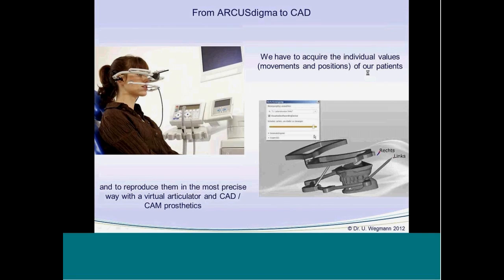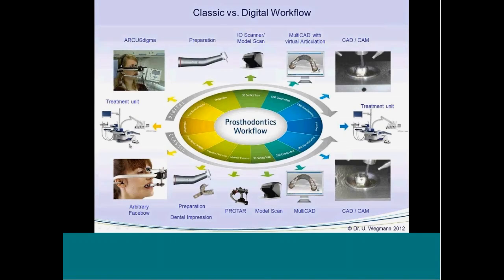And this can change our workflow from a more classical workflow with mechanical facebow transfer and so on to a fully digital workflow. Registration done electronically. Unfortunately, we have to do the preparation up to now by hand, not electronically. But then we send this data, and the data coming from a scanner of the occlusal surface or the prepared teeth, into our CAD/CAM system, and then we can manufacture our prosthetics.